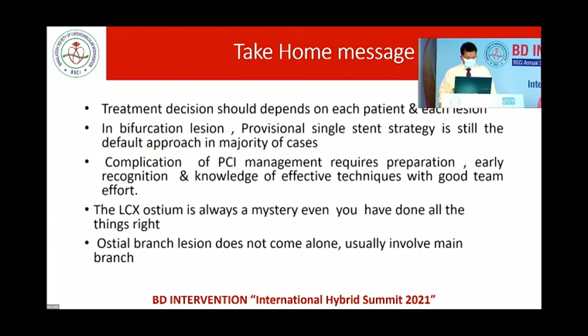Professor Hafiz sir is here. What is your opinion regarding a second stent covering the deformed stent? Number one. Second issue, how much possibility is there of ISR, is it 30-40%? And the third issue regarding the check angiogram: would you prefer CT angiogram, MRI, or conventional angiogram?